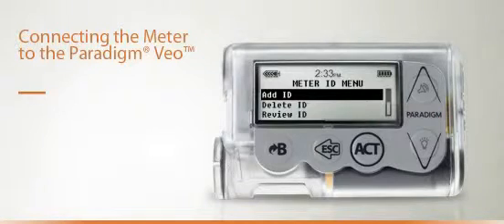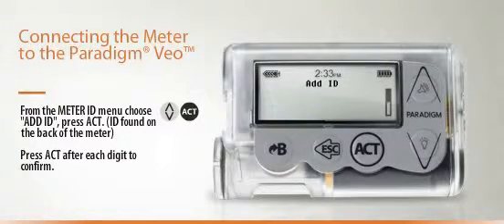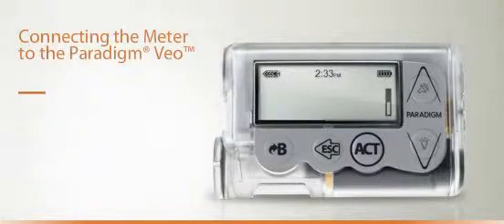Next, you will need to add the ID number of your Bayer contour link meter. After entering each number with the scroll buttons, press Act. Whenever you check your blood glucose with your Bayer contour link meter, it will now automatically send your reading to your Paradigm Veo.